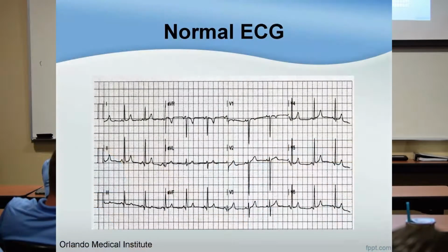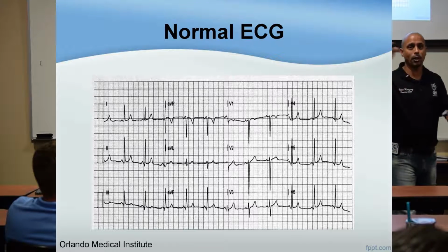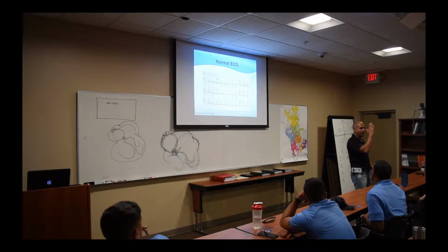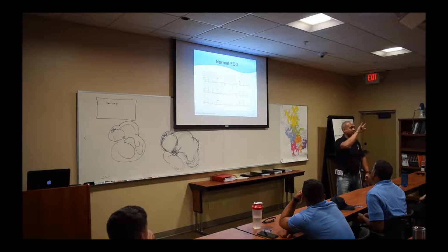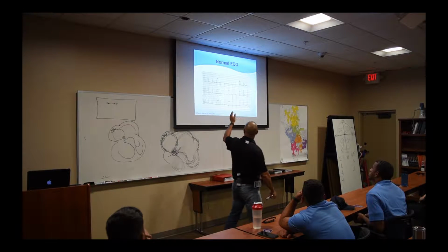Do you know that you could get a 6-second strip on this? Just because I go from lead 1 to AVR to V1 to V4, that's consistent. Count 30 big boxes, that's 6 seconds. They're consistent. Just because there's a break there, it's still a consistent flow. So I can get my rate, and also I can map out and see if it's regular. I can use a 12 lead to do so. All right, so I do that.